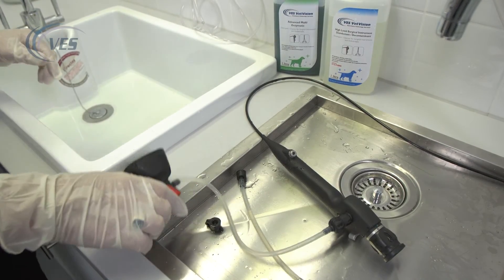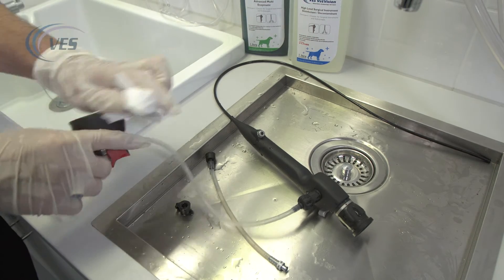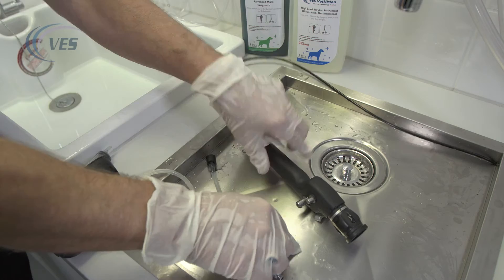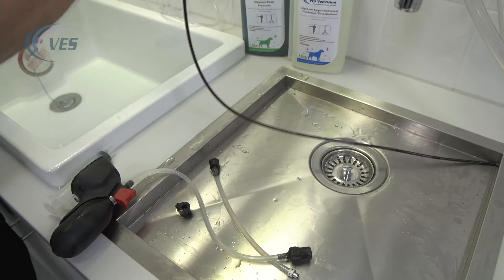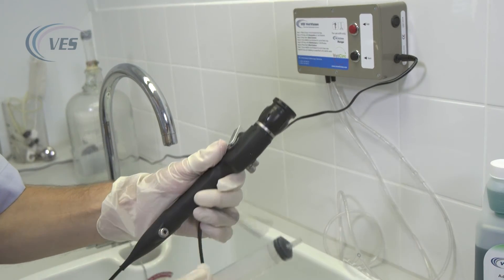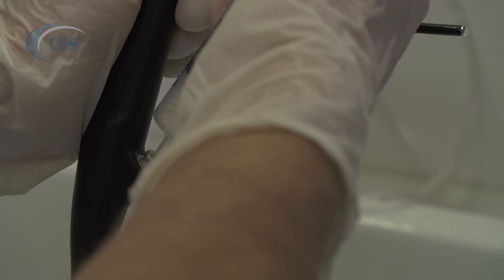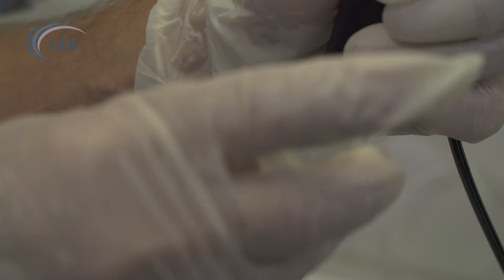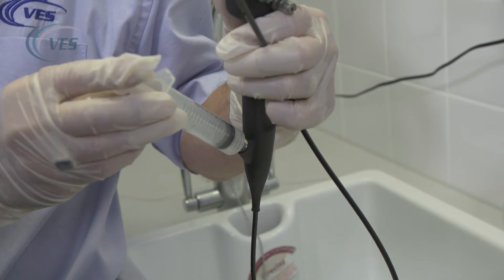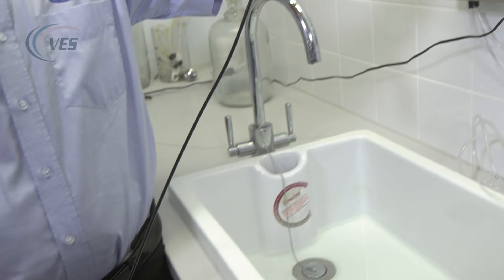What we do next is make sure that the scope is dry. By getting a cloth or a towel, remove the pressure from your leak tester, and carefully dry the scope off. To help dry the channel out, flush air through the channel until you're fairly happy that there's no fluid coming out from the end of the scope. The scope should then either be hung up to dry on a hanger or put back in the case and stored correctly.